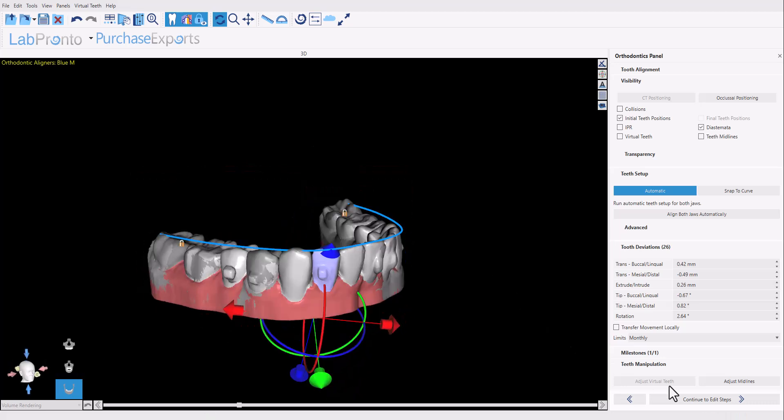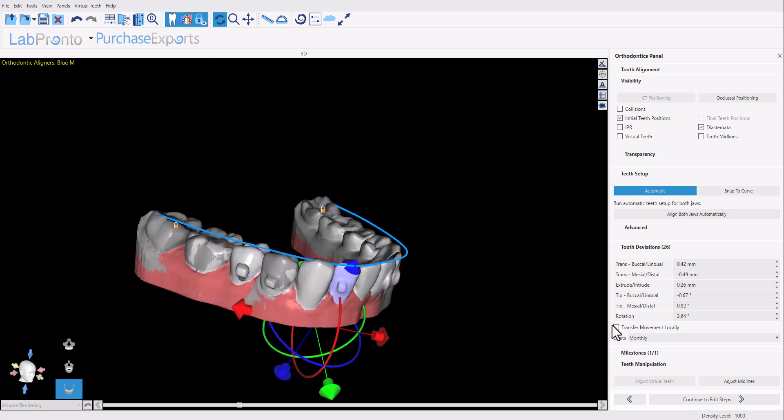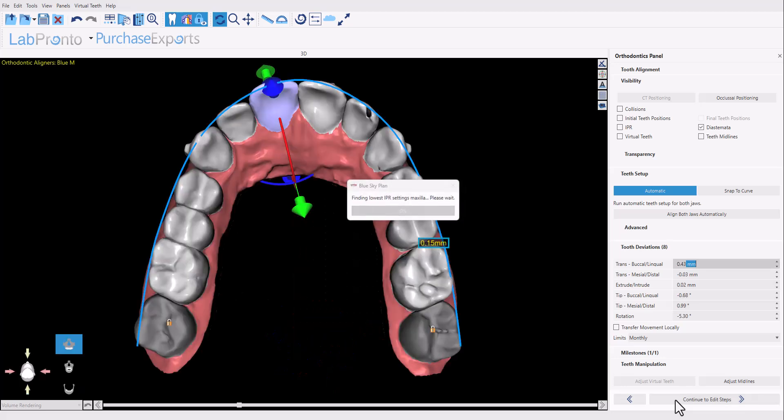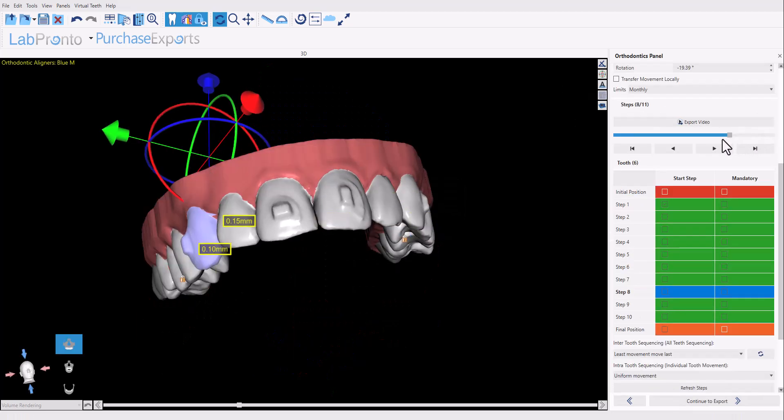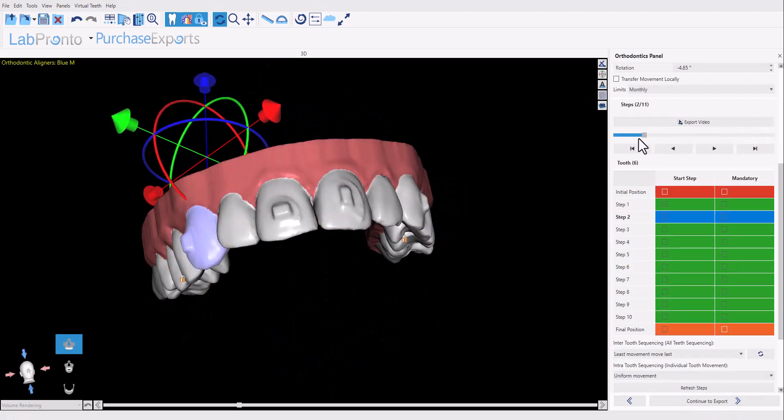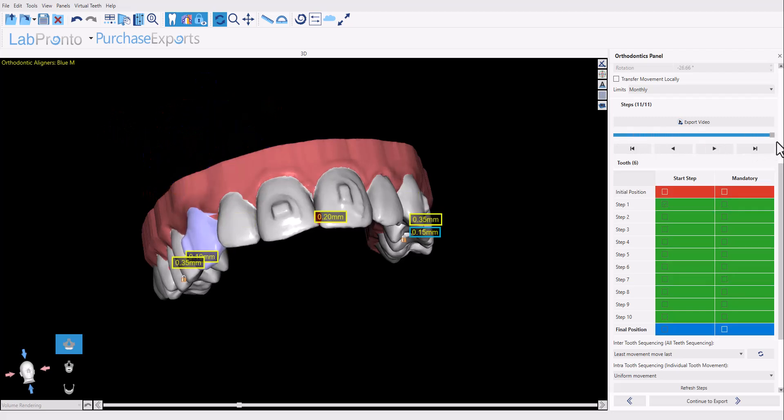We can now click continue to edit steps. The software will prepare the individual steps and the relevant models for each step. The user can confirm and review the teeth movements, modify as necessary. We have additional tutorial videos on different controls to fine-tune the teeth movements and then click continue to export to export the relevant data sets.